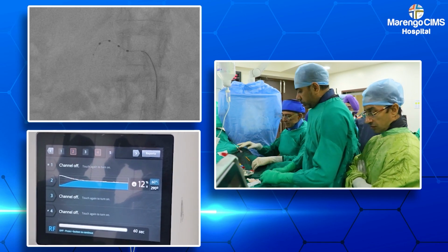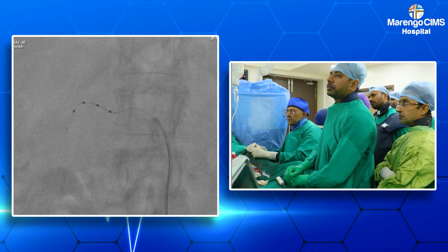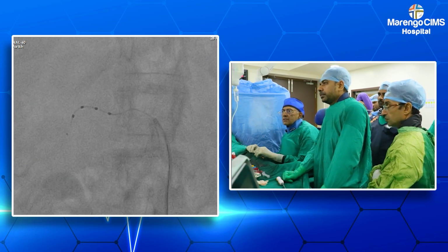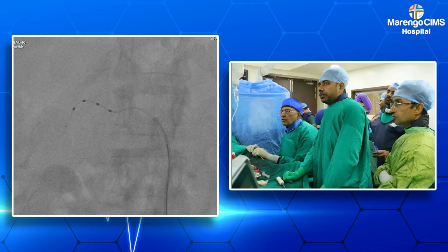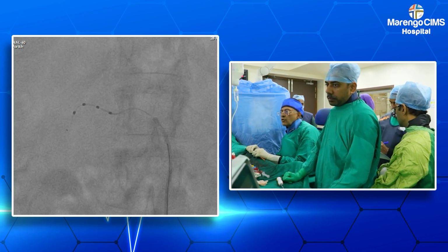Excellent. Again, in some of these larger areas where there is a very high gush flow of blood, the cooling is slightly more, so the temperature rises less. So it does not mean you had a poor contact. So be careful not to re-ablate in that same area again. It was a very successful one.